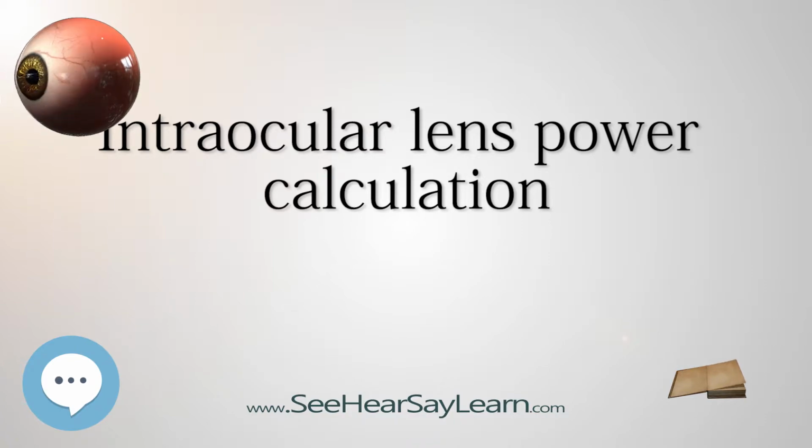However, it is difficult to obtain a measurement in the presence of a dense cataract or other media opacities, which limits the use of this technique. Another advantage of PCI over ultrasound biometry is that the axial length measurement is performed through the visual axis, since the patient is asked to fixate into the laser spot.